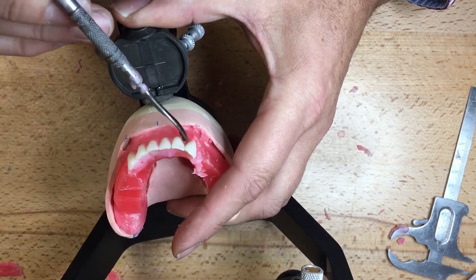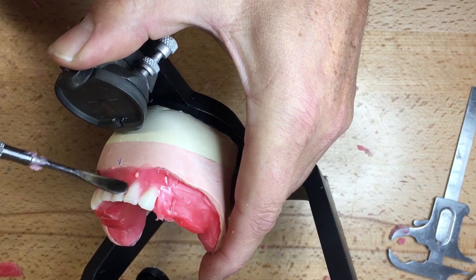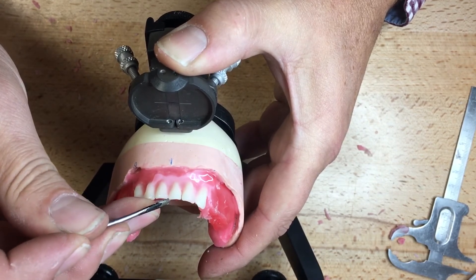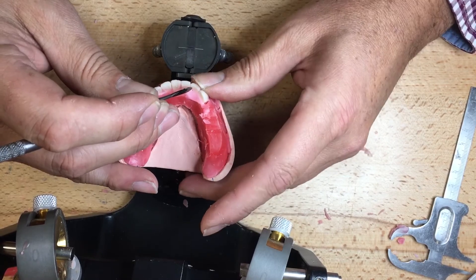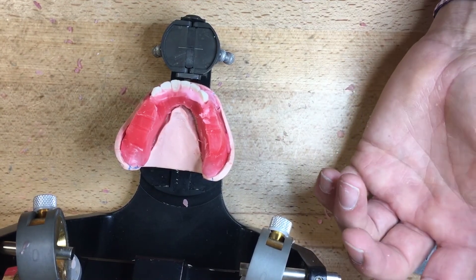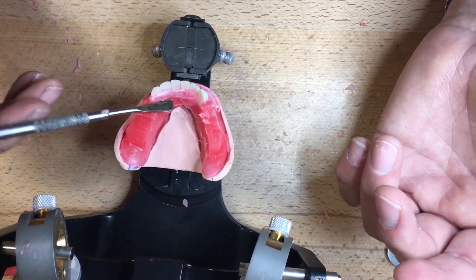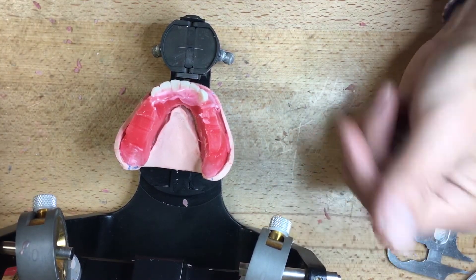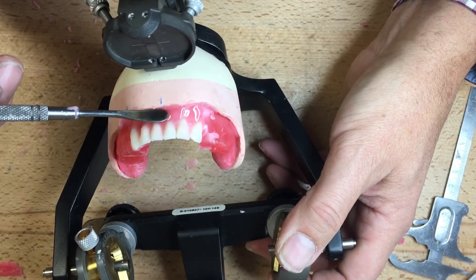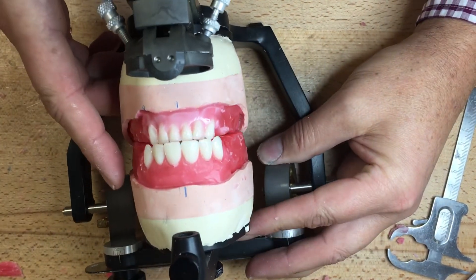The lower six teeth are really the only ones not in contact in centric occlusion because of the overjet. So these teeth are not in contact in centric occlusion or centric relation — the bite record — and we have some freedom to do aesthetic things with the anterior six, such as crowding. If following Dr. Gizzi's 20-year setup, we would put these six teeth last. I apologize to those thinking why is he putting those teeth on so soon — but I think this approach is easier for education purposes and the results are just as predictable, if not more so. I'll be back with the lower posteriors.